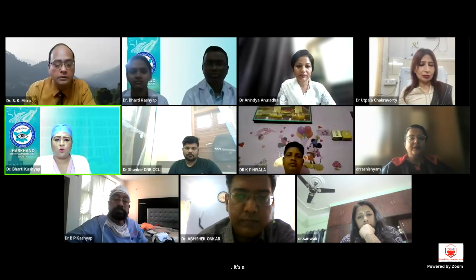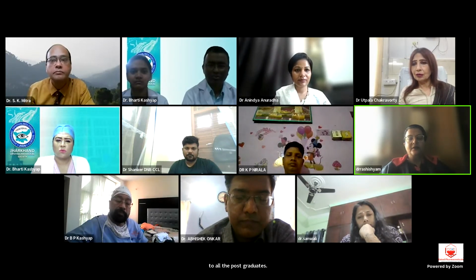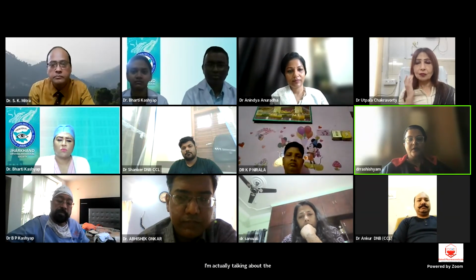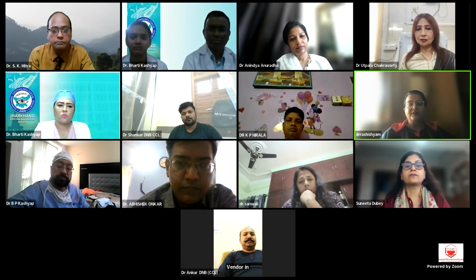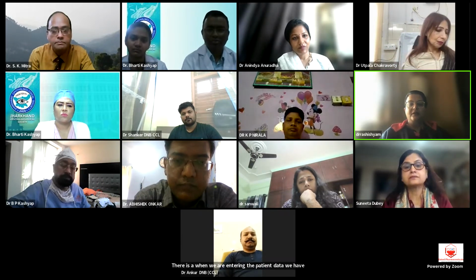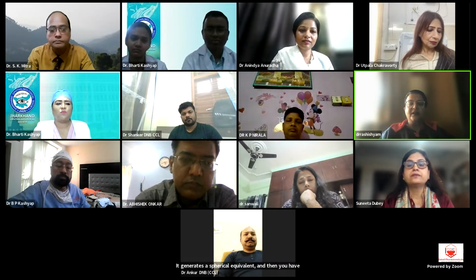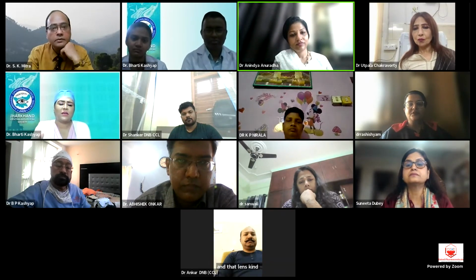Actually, Dr. Bharti, ma'am, in Humphrey, when we are entering the patient data, we have to enter the power also. And it generates a spherical equivalent. And then you have these power lenses that you have to mount onto the machine. And that lens comes in front of the patient's eye. So it is a spherical equivalent of distance and near. That is what helps the patient to see clearly.